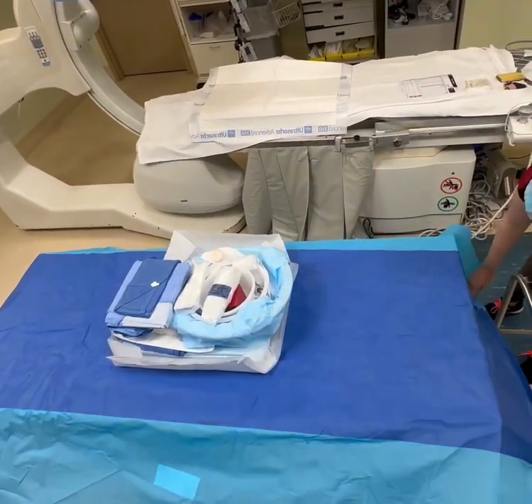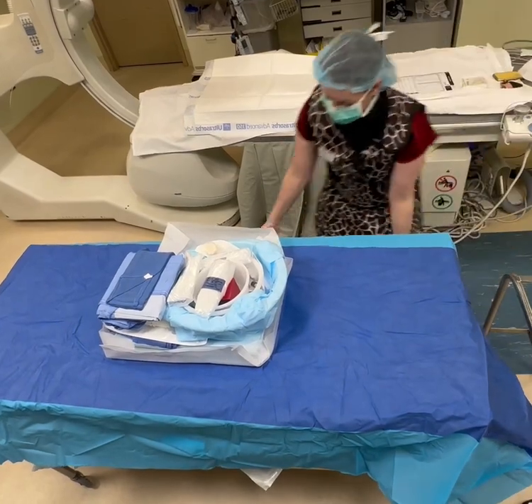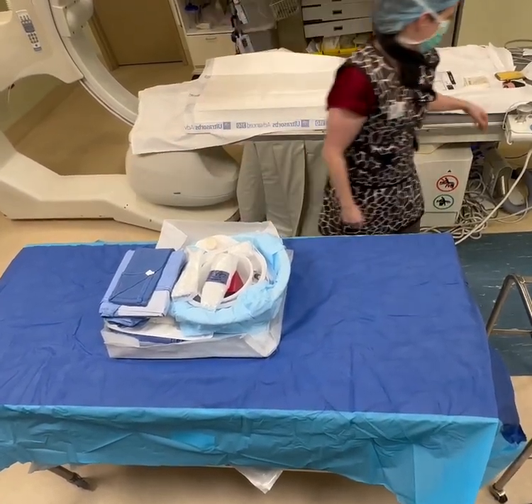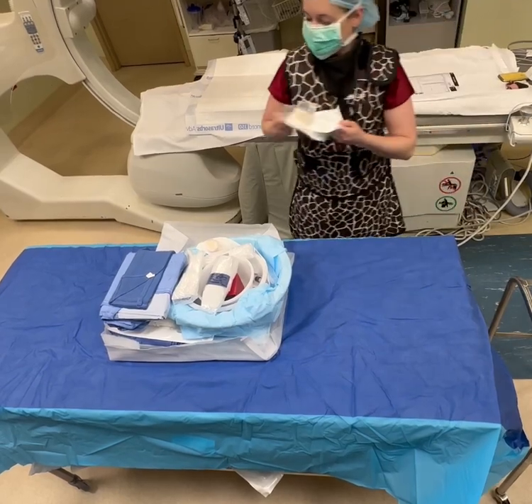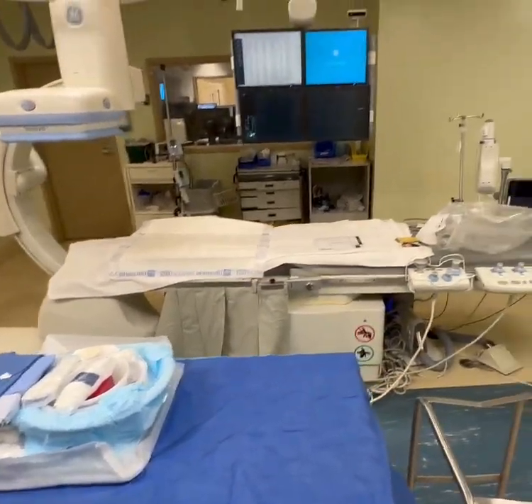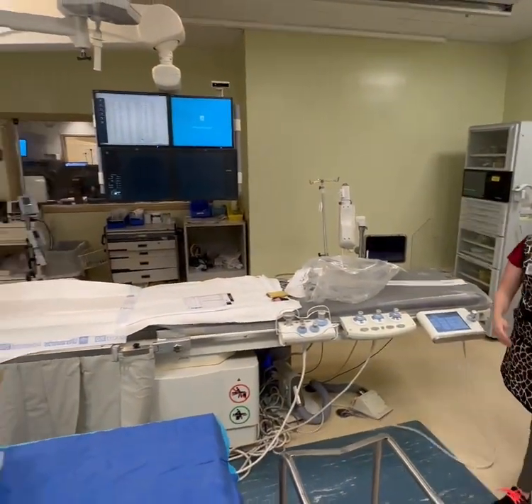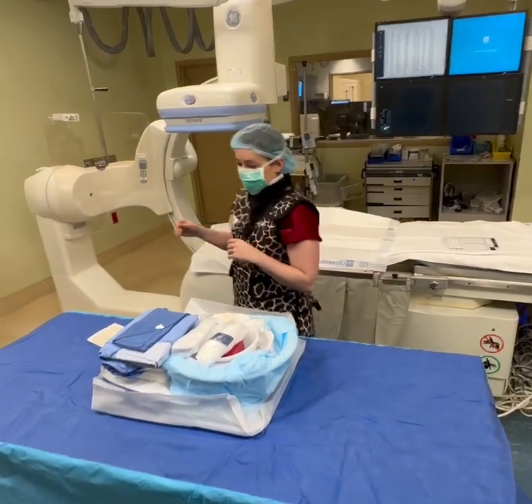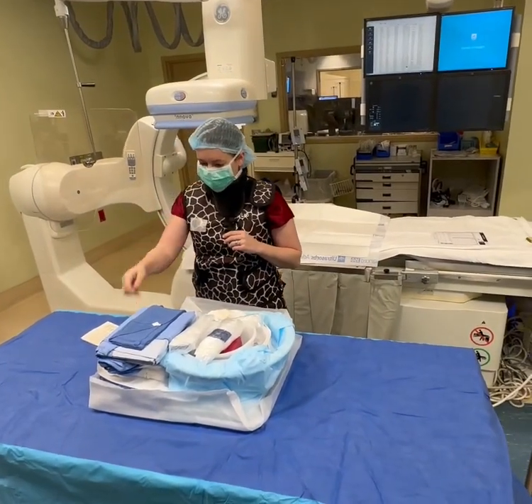Same thing. Pull it down. I'm going to line it up because I want the absorbency of the drape to be in line with my table as much as possible. And I've got my sterile gloves. Then I'm going to do the aseptic hand technique again. Okay. All right, I'm going to come in here and I'm going to grab my gown.